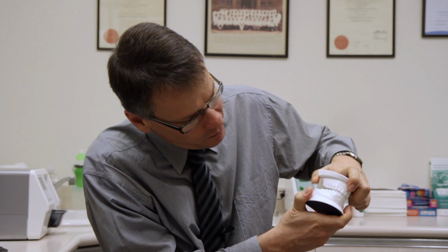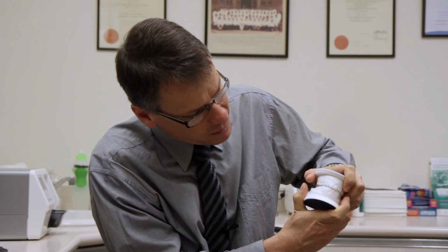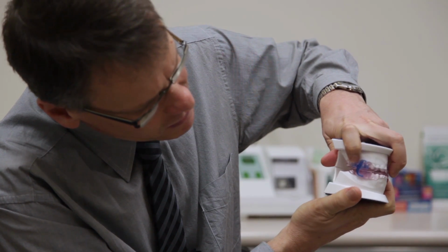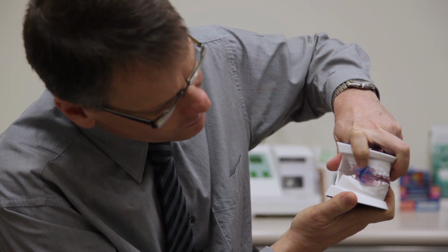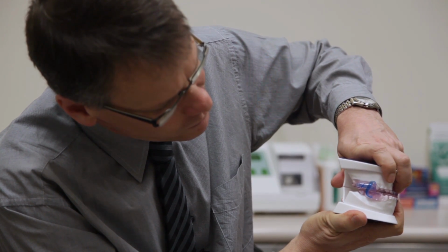So that's where the person's normal position is, and now I'm going to demonstrate to you what the oral appliance looks like. So basically the oral appliance is divided into two parts. There's the upper part and there's the bottom part, and then if you look at it sideways, there's a little bar over here, and with special screwdrivers, we can actually titrate that. What titration means is that we can move this part of the appliance, and that causes the bottom jaw to go forward.